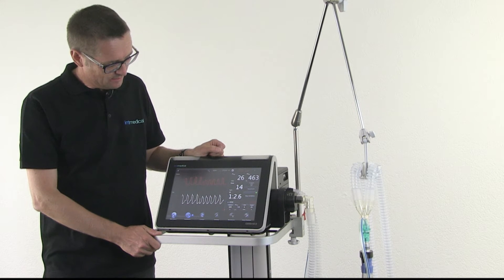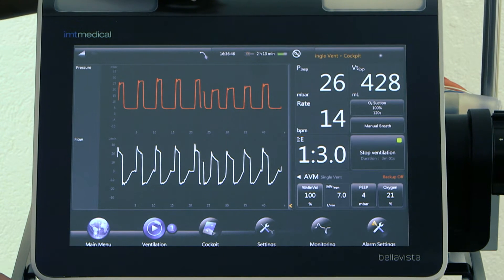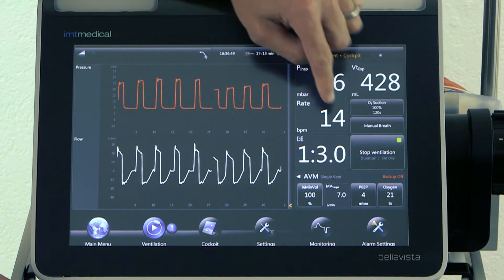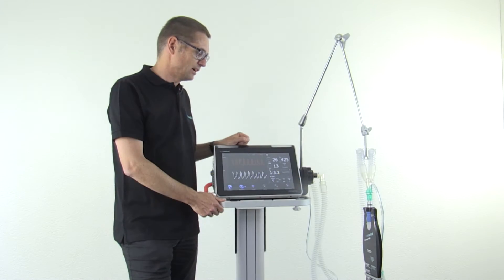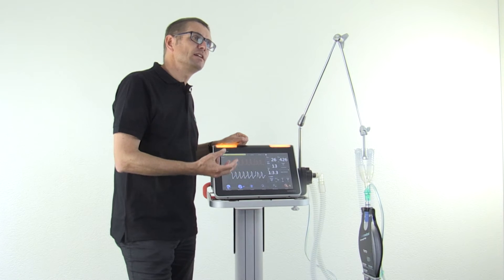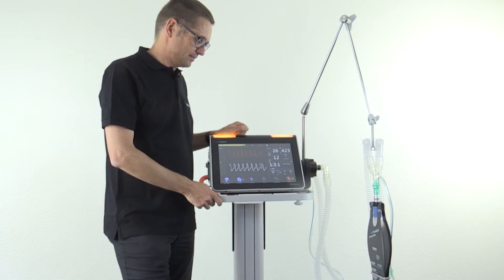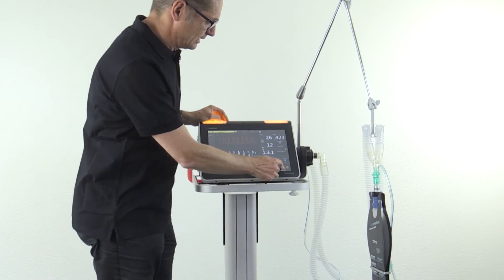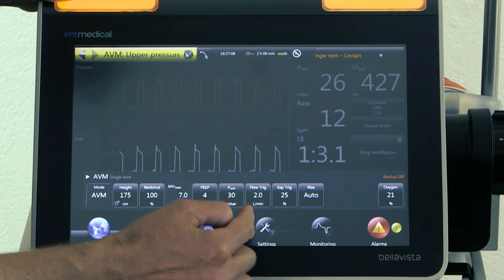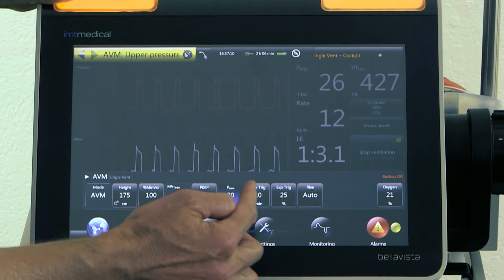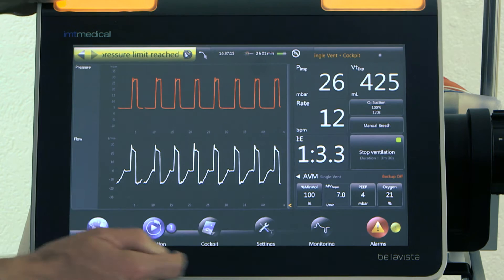It's still regulating. The I:E ratio has reached 1 to 3 now and may go further. The rate is coming down — going to 13 and maybe further. AVM is completely automatically adapting to the patient's lung mechanics. Now it has reached the maximum regulation — the P limit. I increase the P limit a little bit to give it full freedom of regulation.